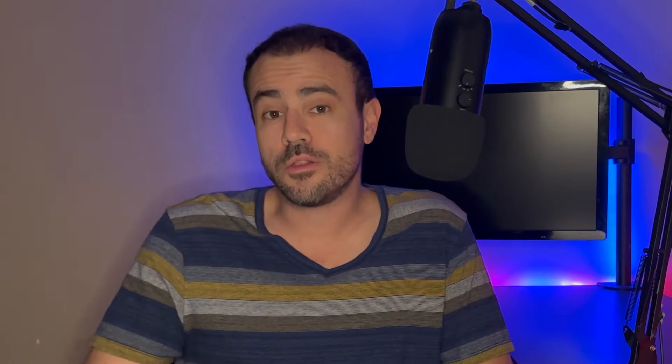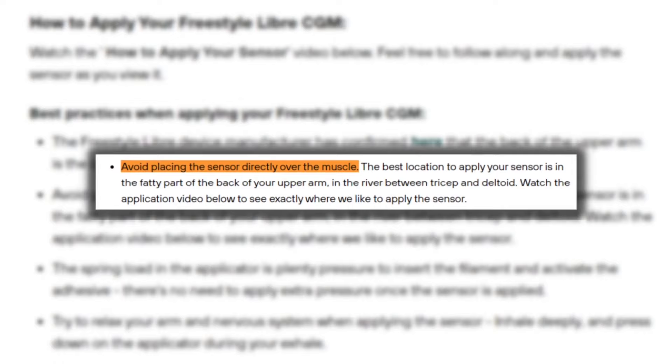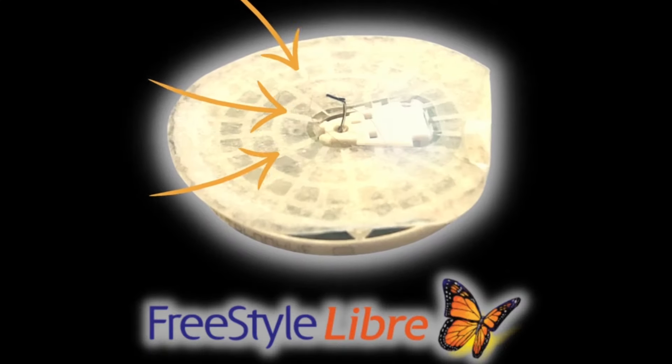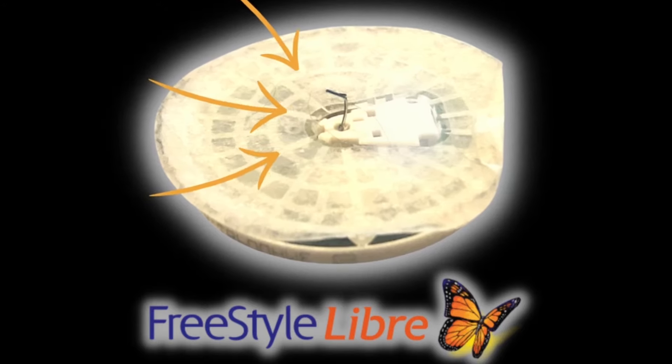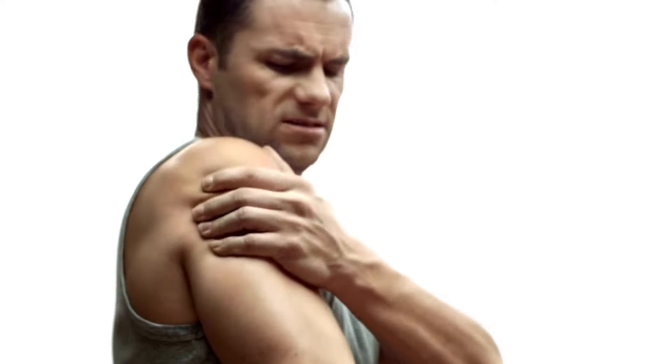If you place the Libre sensor too high on your arm, you'll wind up placing it over the deltoid muscle. If you place it too far forward, you'll put it into the bicep muscle. When the sensor is placed close to or in a muscle, the tissue is much more dense, which can cause the filament to bend, leading to inaccurate readings and even failed sensors. It can also be more painful. So make sure you're putting it in the back, middle portion of the upper arm where the soft and flabby portion is.